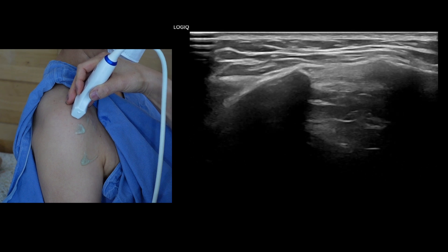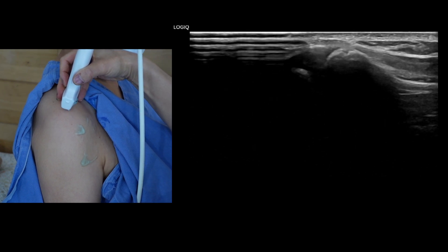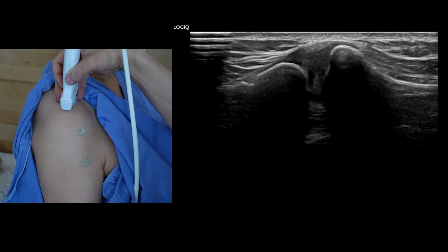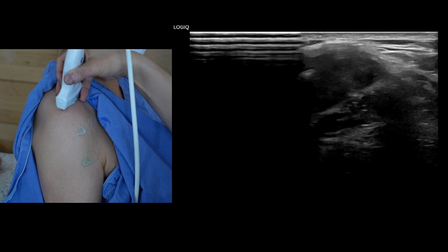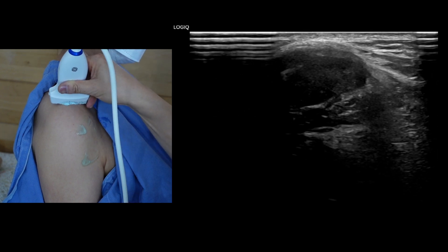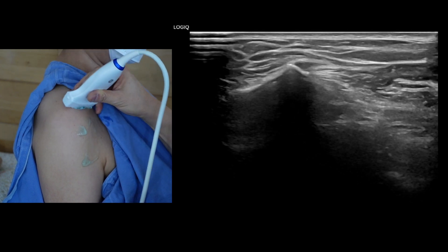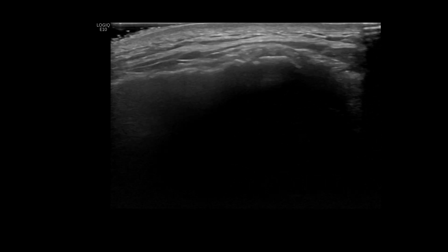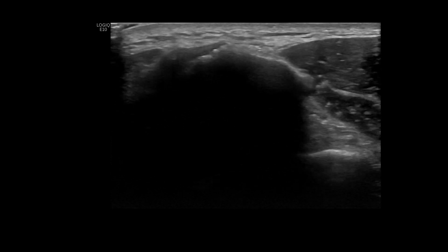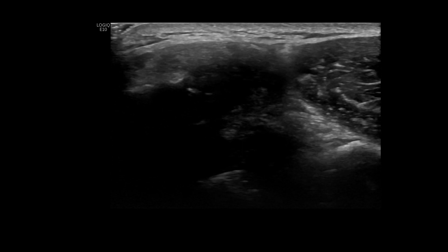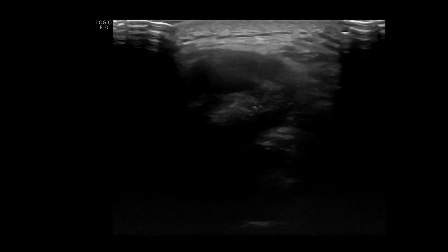Position the ultrasound transducer coronally over the shoulder to examine the acromioclavicular joint. Glide the transducer back and forth from anterior to posterior across the joint to evaluate for any effusion. Palpate the AC joint while scanning to correlate any tenderness with the observed pathological changes. If there is suspicion of dynamic instability, maneuvers should be conducted to assess the stability of the AC joint during the ultrasound examination.